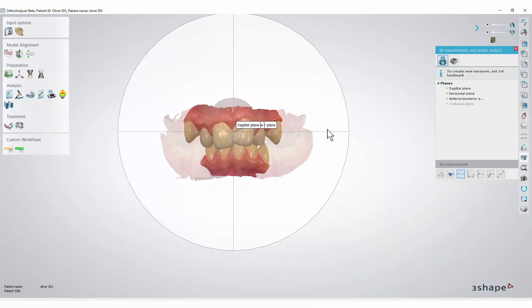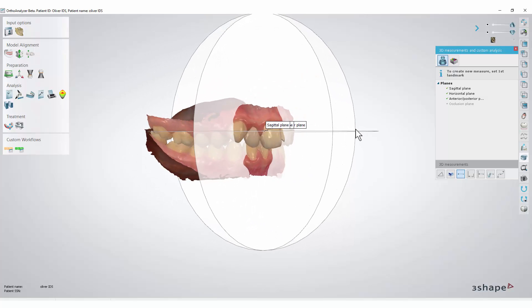You can hide the planes if you want. To do that, when in the 3D measurements window, right-click the planes text and select hide items.